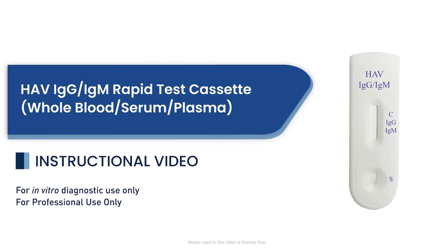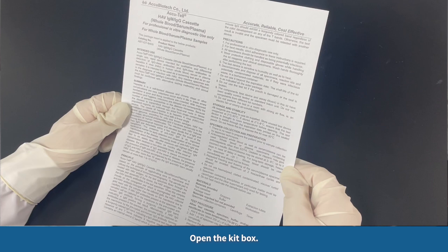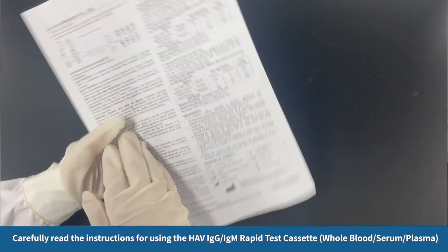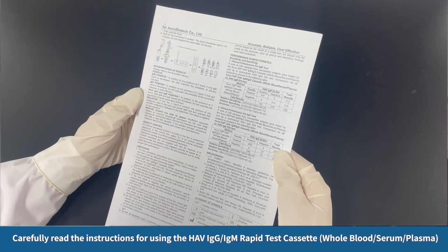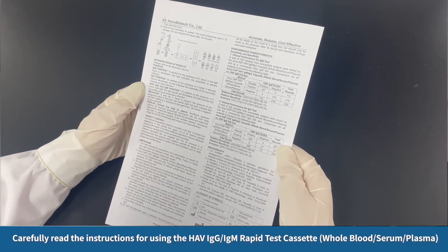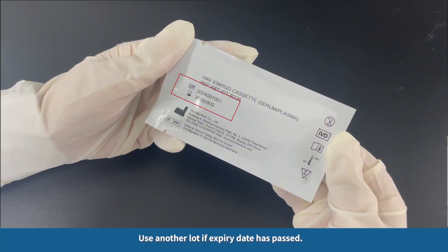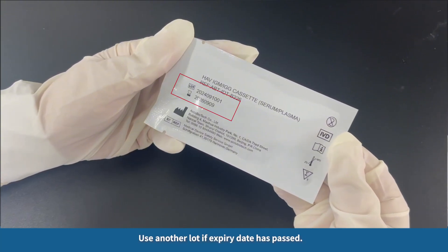HAV IgG IgM Rapid Test Cassette — Whole Blood, Serum, Plasma — Instructional Video. Open the kit box and carefully read the instructions for using the HAV IgG IgM Rapid Test Cassette. Look at the expiry date on the back of the foil pouch, and use another lot if the expiry date has passed.